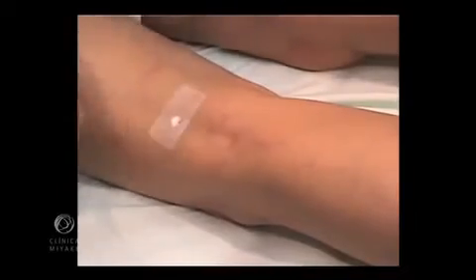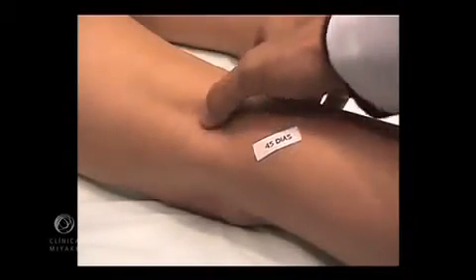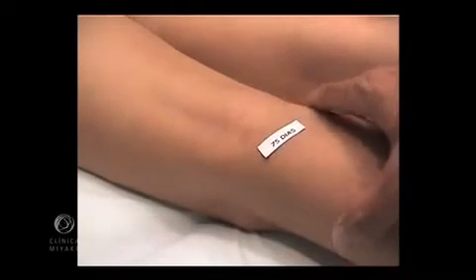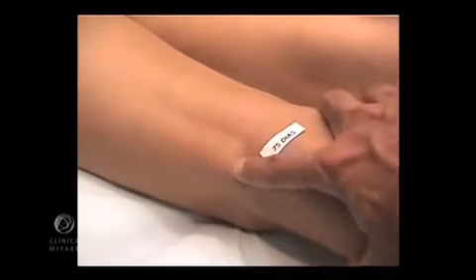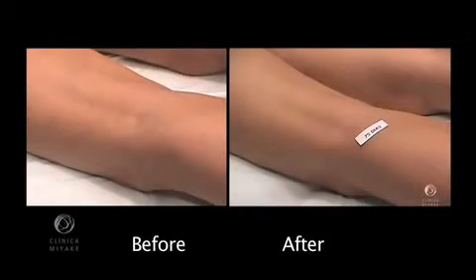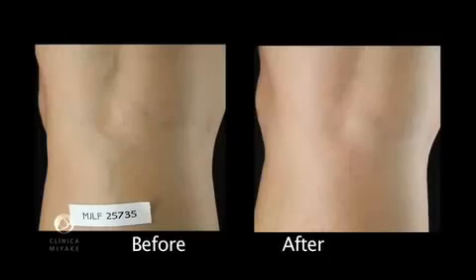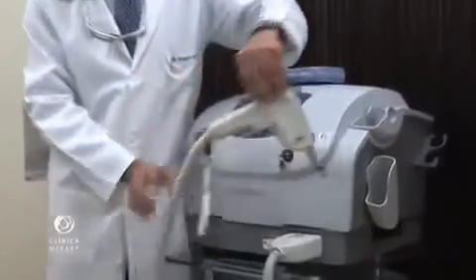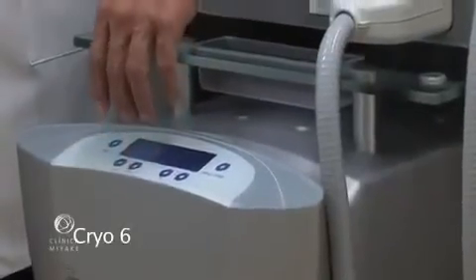Many of us agree that on leg veins, transdermal lasers were not the gold standard. But nowadays, 1064 long pulse lasers achieved selective photothermolysis. The laser action is very focal, and when employed adequately, it is a very effective method. The laser we use nowadays is the 1064 Harmony. And to numb the skin, we use the Cryo 6 cooling device.